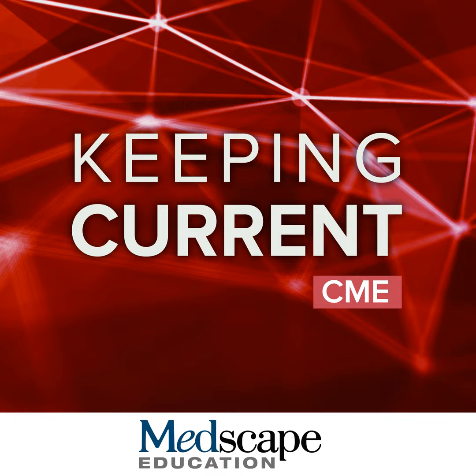I want to really highlight, however, that hepatobiliary phase hypointensity is not specific for HCC because multiple other things can give you hepatobiliary phase hypointensity. As you can see here, benign, other malignant lesions, non-lesions, they can all produce hepatobiliary phase hypointensity. So we should not look at it in isolation. We look at other sequences. And you have to keep in mind that hepatobiliary phase hypointensity is specific for an area which lacks functional hepatocytes. Okay, back to hepatobiliary phase hypointensity.